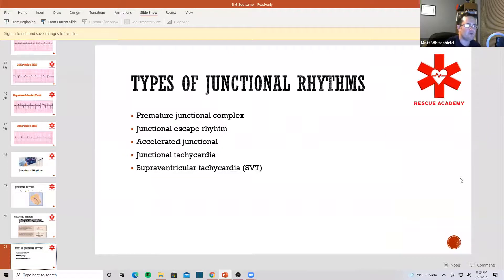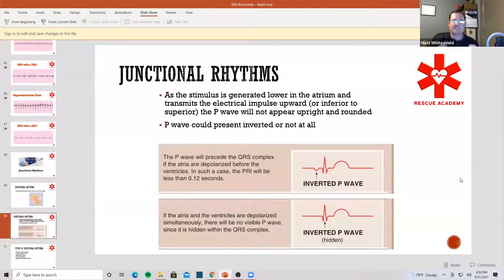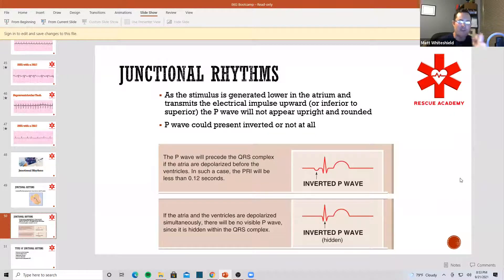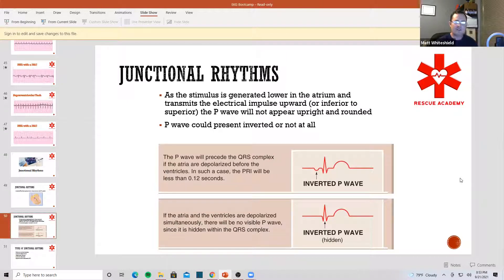Let me repeat the rules. This is going to look just like sinus — narrow complex QRS complexes — but you're going to have an inverted P-wave or no P-wave at all. Don't make this more confusing than it needs to be. The difference between junctional rhythm and sinus is that there's no P-wave or it's just inverted. That's it.